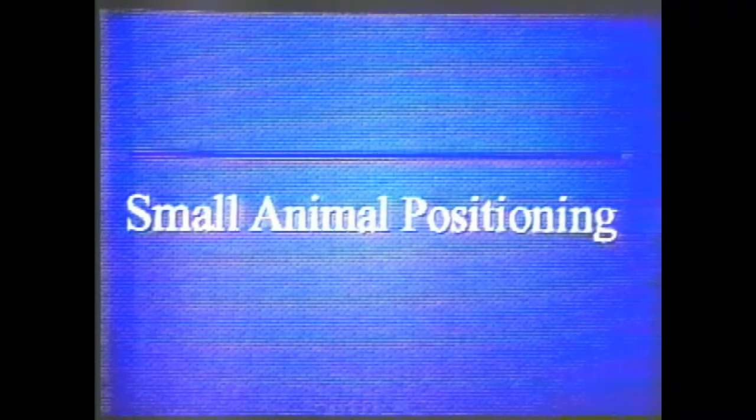The second principle is distance. For most of the positioning areas, we have demonstrated chemical restraint along with positioning devices and the use of tape so that the personnel can be completely out of the room at the time of exposure. With the personnel completely out of the room, this will provide the lowest dosage possible to those individuals.